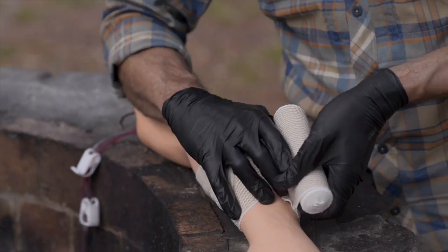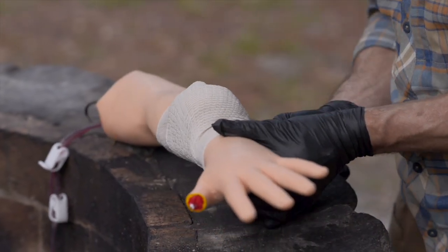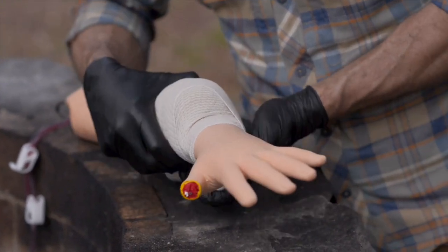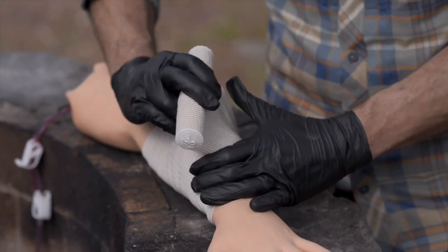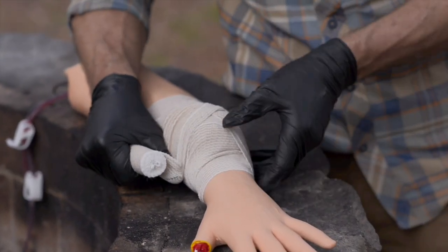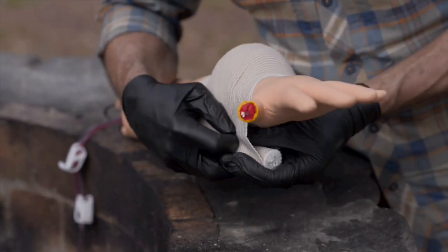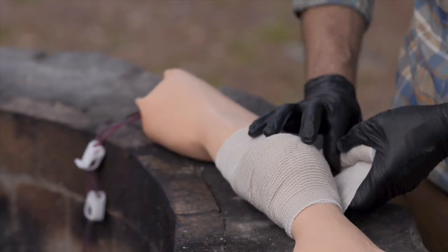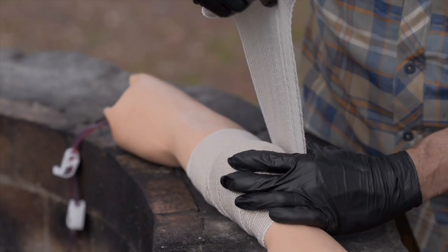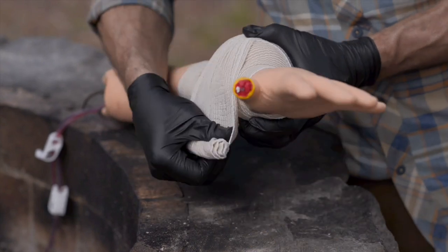Pull tight. I'll wrap this around both sides. Then I'll come back over the center. Every time I come over the center, I'm placing another hourglass shape twist in there. And I'll continue around till I get to the end of my dressing. Over one side, over the other. Coming up over the center, place a twist in directly over the top of the wound.